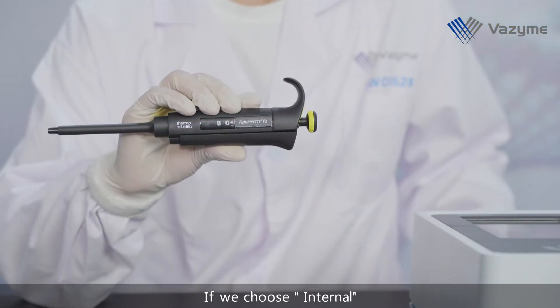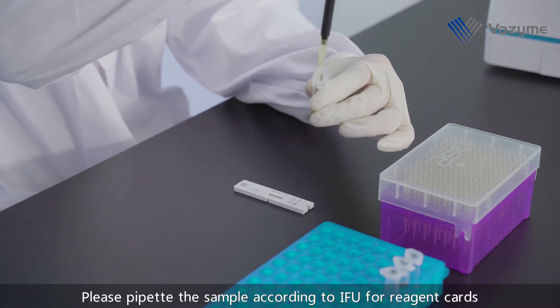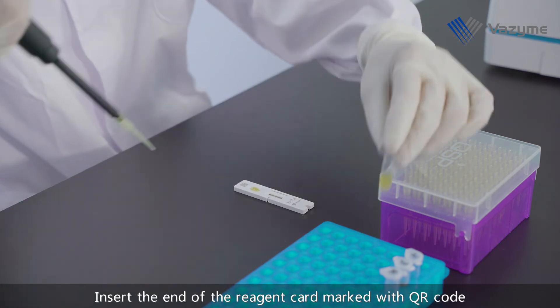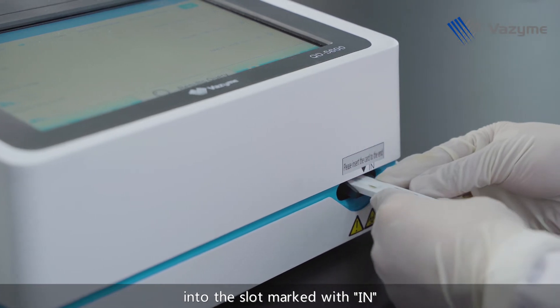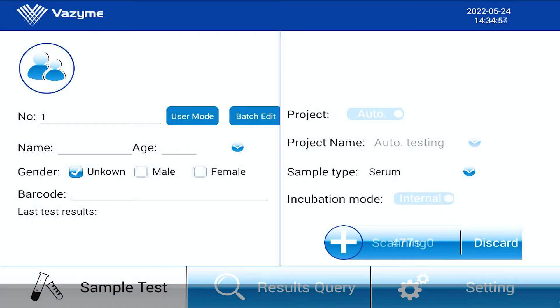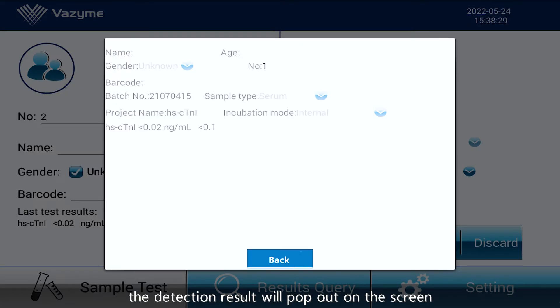Choose Internal for inside incubation. Please pipette the sample according to the IFU for reagent cards and add it vertically into the sample well. Insert the end of the reagent card marked with Quick Response Code into the slot marked with IN and open the right panel of the instrument. Then tap Start.